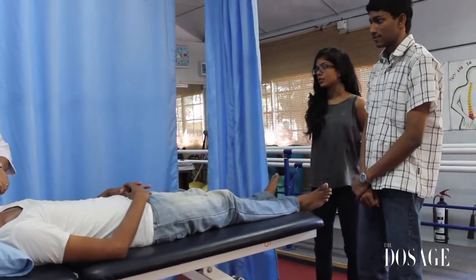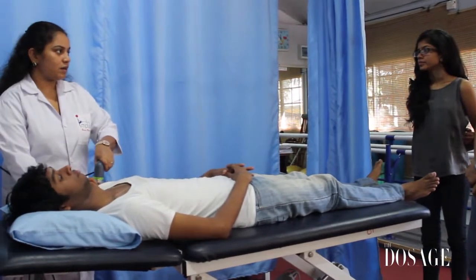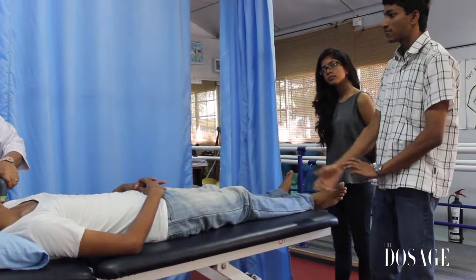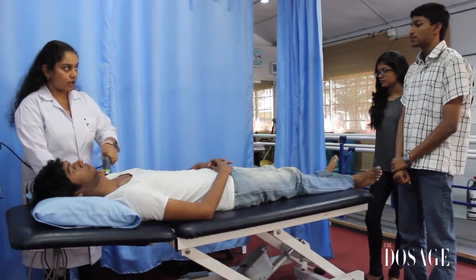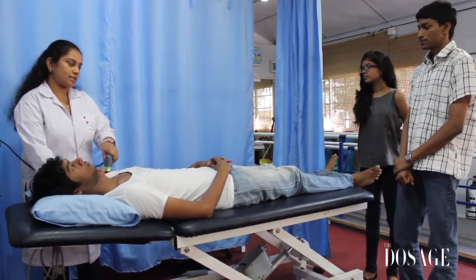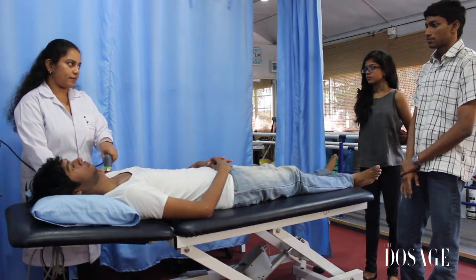How long do you treat it for? It takes only 6 minutes. Okay. But over a long period of time, are there repetitive sessions? Yeah, he has to take this treatment for the next 5 days, and then once the pain subsides, we will ask him to come once or twice a week.